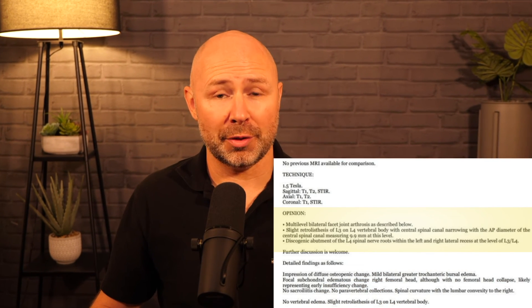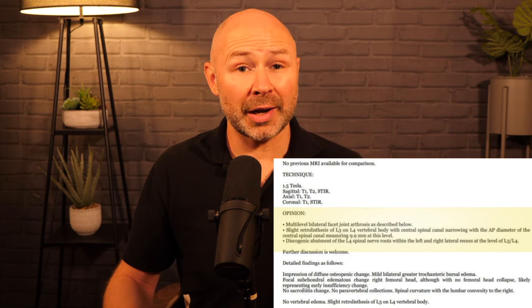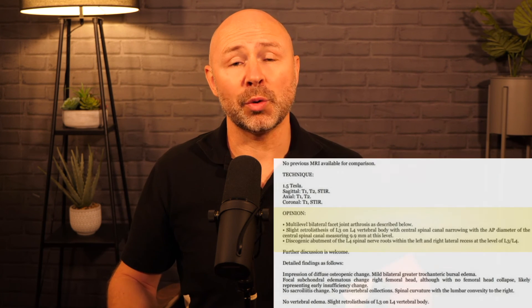That's the findings section done, so let's look at the opinion section at the top of the first page. Listed here are the most relevant findings. Multi-level bilateral facet joint arthrosis is mentioned, as is the slight retrolisthesis of L3 on L4. Probably the most clinically relevant finding is the central spinal canal narrowing measuring 9.9 millimeters at that level. There is some discogenic abutment at L4, however with no information on neurological symptoms at the L4 spinal nerve level and no physical examination findings we cannot be certain. I'd personally be interested to know if they also experience pain into the buttocks, legs, or feet; evidence of foot drop; loss or change of sensation in the legs or feet; and whether they struggle to walk downhill but walk better uphill.